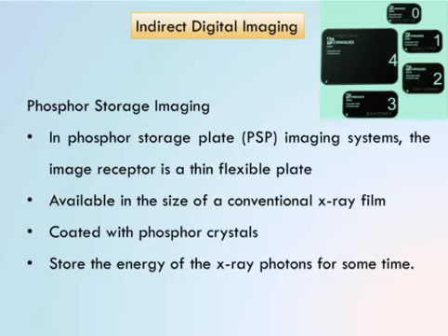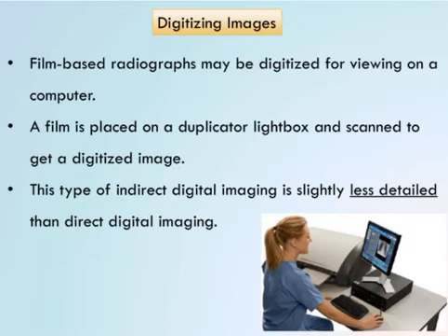We are going to use a scanning device to scan the images from the PSP systems. Okay, so that is how it differs from direct imaging. So the problem also exists when you have to scan and get the image. There is some delay in the imaging time. Okay, so a direct digital sensor like the one that you use in the lab gives you instant images on the desktop or the monitor, whereas with an indirect one, you need to scan it to take the images.